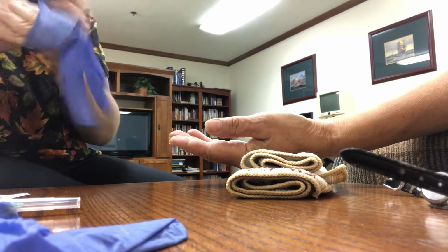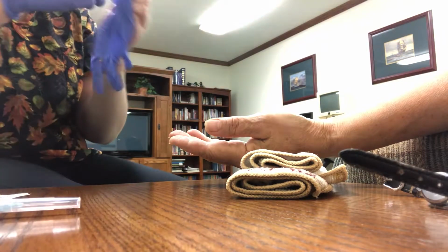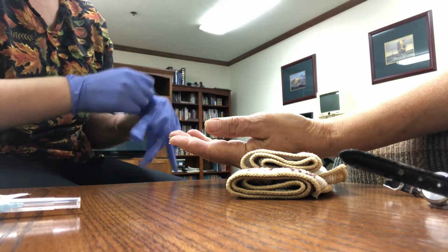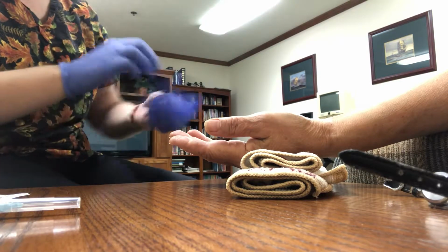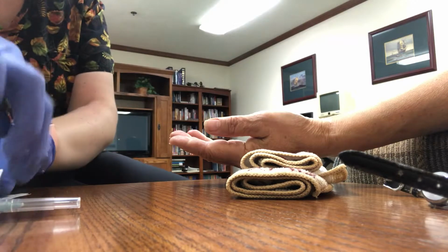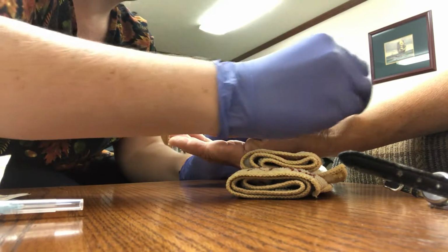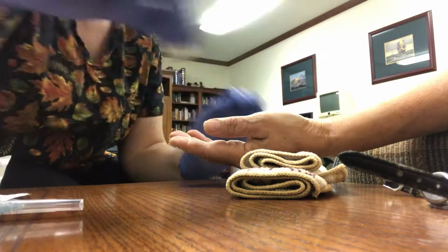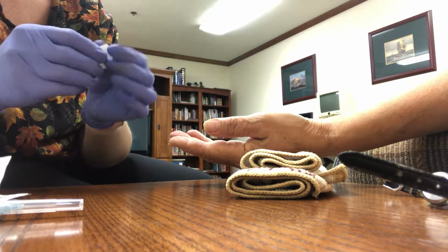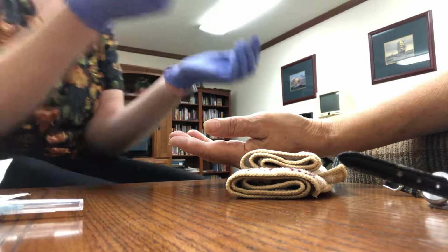So go ahead and get gloves on, and then what I'm going to do is just clean the skin with an antiseptic wipe so that we can make sure the area is clean before we penetrate the skin. Okay, so I'll go ahead and wipe the skin here, and then I'm going to wipe the tips of my gloves as well.